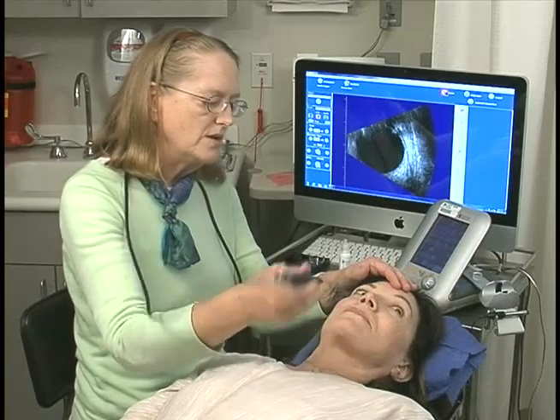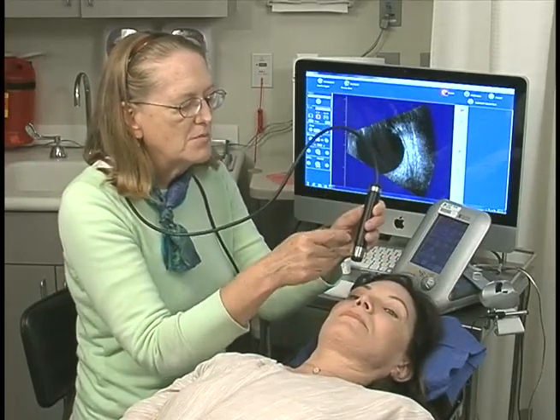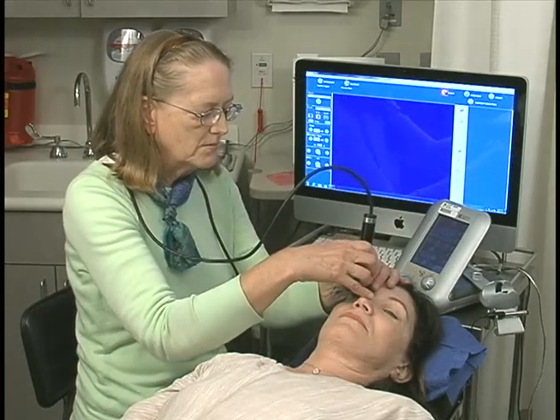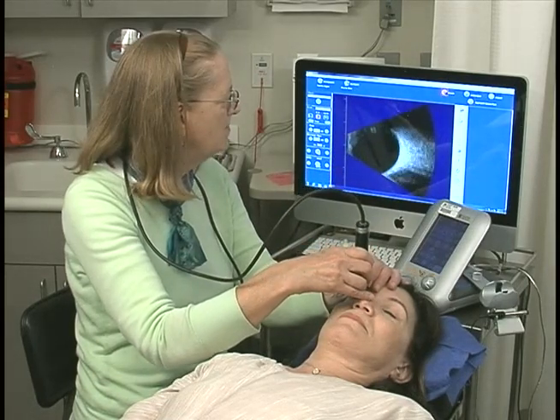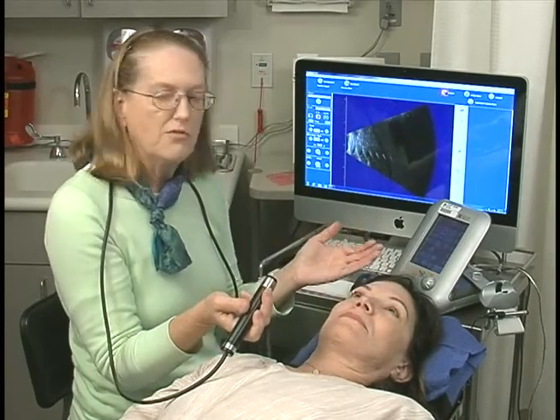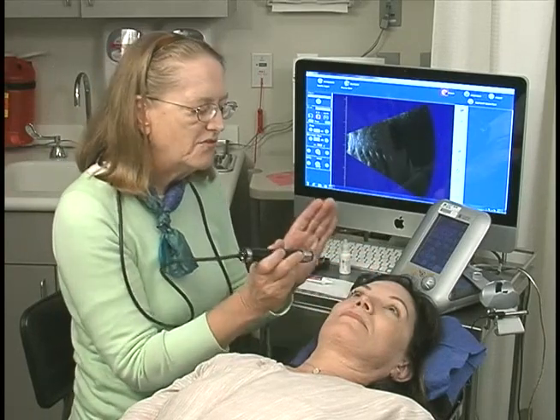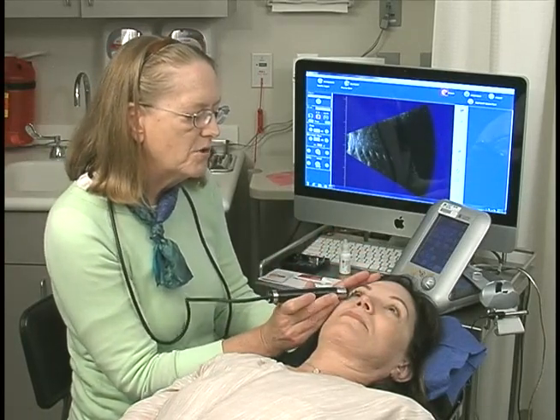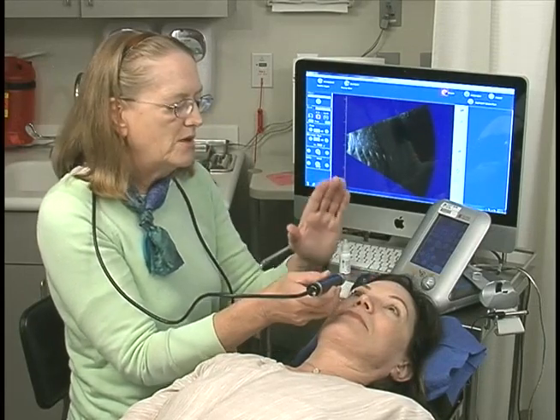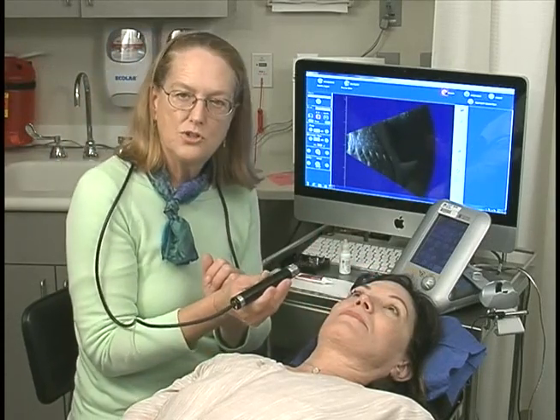That's how anterior periphery you can get with good patient cooperation and probe position. Now we'll look at the inferior — so look way down. This will be a longitudinal of 6, the marker pointed toward the clock hour being imaged. Optic nerve at the bottom, anterior periphery at the top. And those are the four longitudinal scans. It's very useful to look at the superonasal and supertemporal areas very carefully when you have a patient with potentially retinal tears — that's how you'll find a retinal tear. And that covers longitudinal scans.